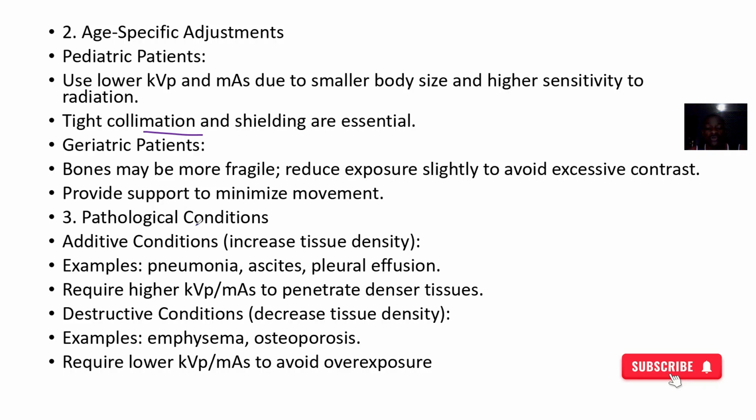So you also adjust the exposure, all those rays and everything, and this also depends on the part of the body you are dealing with. If I want to image the stomach, it is different. If I want to image the brain, it's different. If I want to image the pelvis, it's different. If I want to image the leg, it's different. Do you understand? So that's what we got.